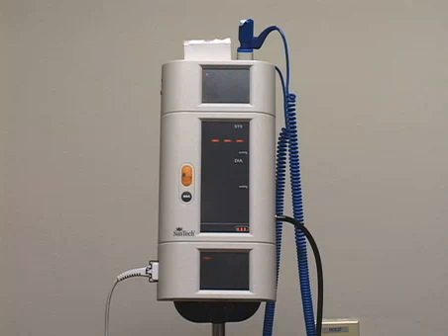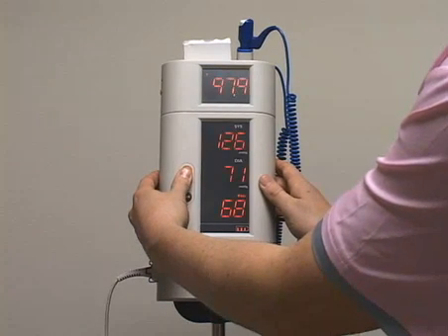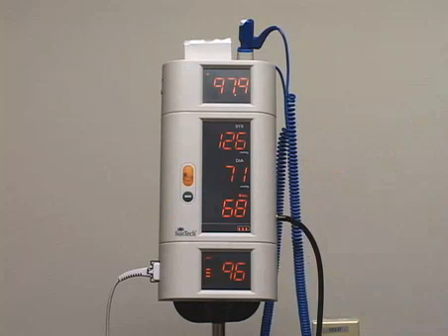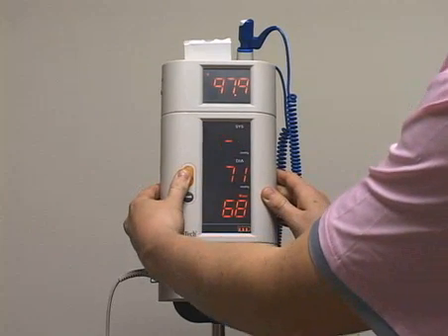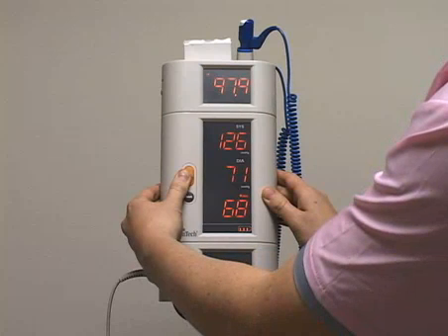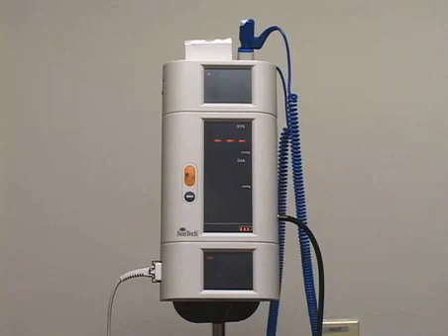To recall the last reading, press the automatic button for 2 to 3 seconds. Press and hold the automatic button for 5 to 6 seconds to delete the last reading. Once deleted, the data cannot be retrieved.